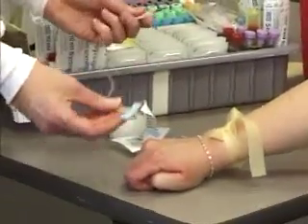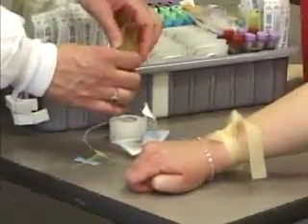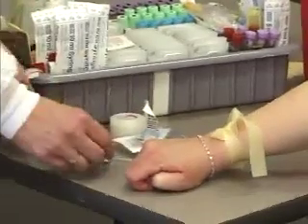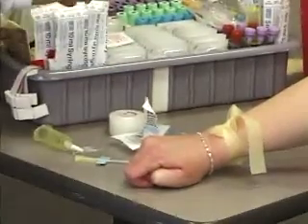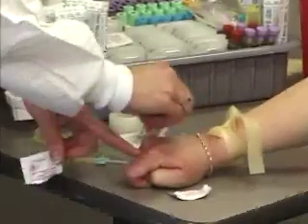It's going to assemble very similar to the vacutainer needle. You want to put your holder on the end, which allows you to use the evacuated tubes. You're going to clean the site — again, in a circular motion — and you want to let it air dry.